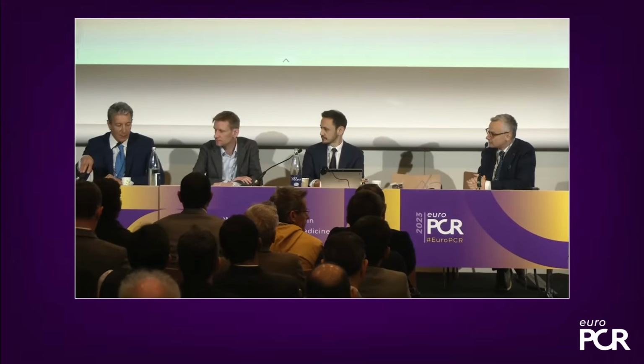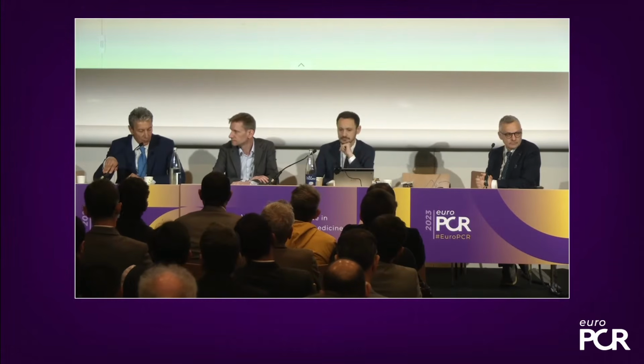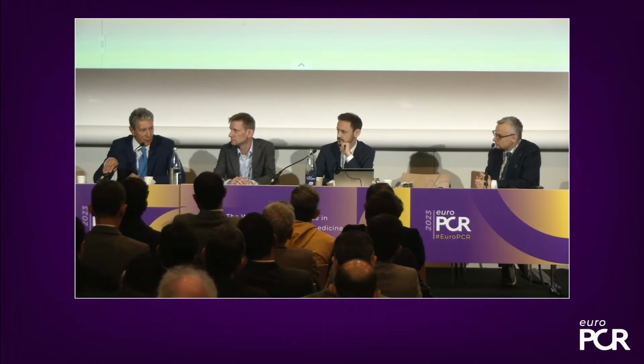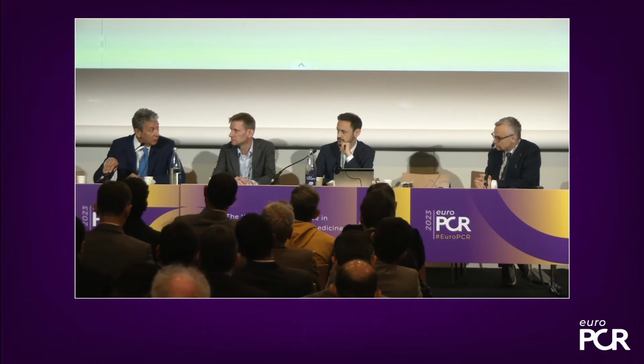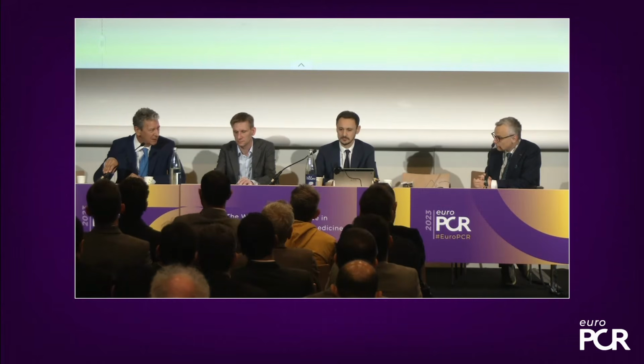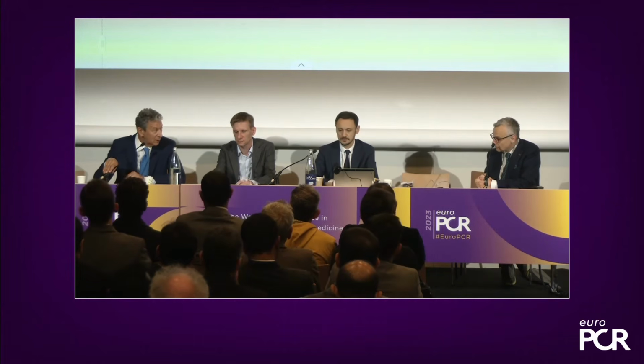In my practice, for instance, the worst location for a puncture is the bifurcation. If you really puncture the bifurcation, there is zero opportunity to fix it percutaneously. Usually we always convert surgically. Yes, because the main problem is when you do the puncture distal to the bifurcation. This is the real problem, as well. And especially if you do the puncture in the profunda, because from a surgical point of view, to repair this vessel is extremely complex.